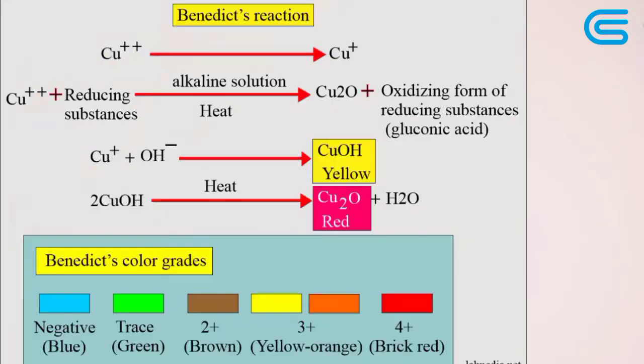So we also have reducing substances in urine, and generally they are substances that are able to supply an electron to copper ions. The two copper ion is blue in color. When reduced to one copper ion, it will turn to a color called brick red. So of course, reducing substances can be formed in urine, and they can appear in the presence of sugars. Sugars include glucose, fructose, lactose, pentose, galactose, and salicylates. And non-sugars such as drugs, glucuronic acid, creatinine, uric acid.